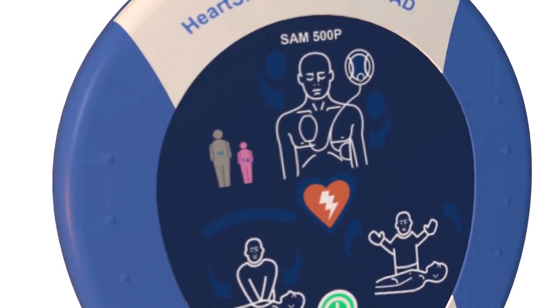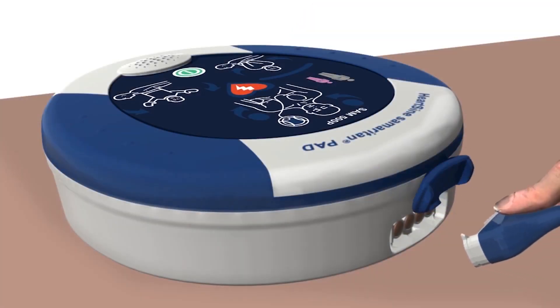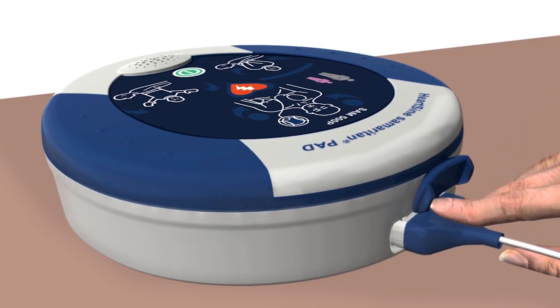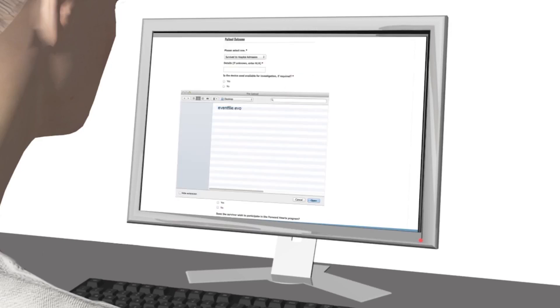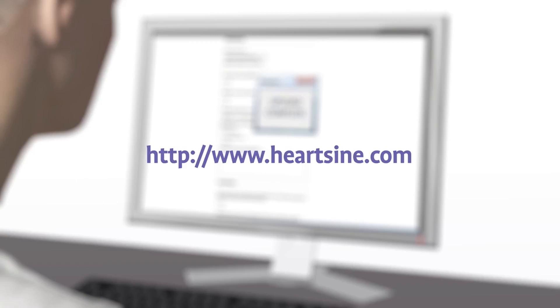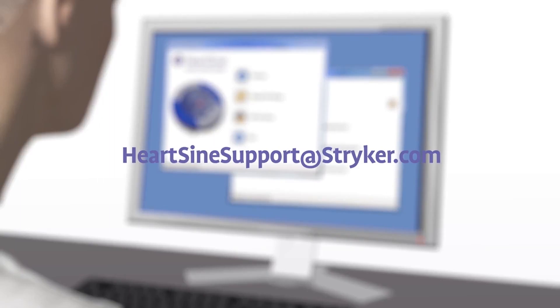The Samaritan PAD stores up to 90 minutes of ECG information after use. Use the Saver EVO software, which can be downloaded from the HeartSine website, and the custom USB data cable to download the event data for a physician who may want the information to help inform treatment decisions. After using the Samaritan PAD during a sudden cardiac arrest, submit the Saver EVO file and a completed customer event form, and HeartSine will send you a free replacement pad pack.